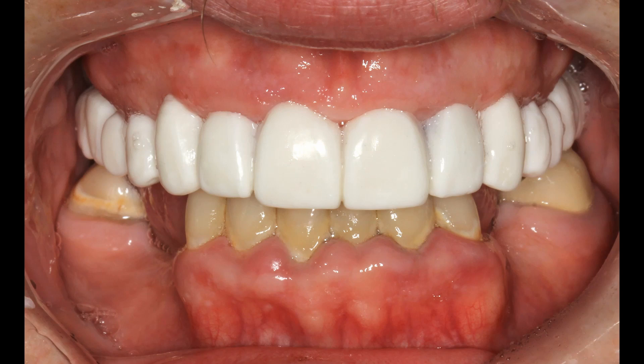I'd like to point out that when a patient plans to do their opposite arch in the future, we never allow that arch to dictate what we do while we're restoring the opposite arch. If you look over here, these molars — because they haven't had any teeth touching them for so long — they've come up through a process called super eruption, meaning they've moved from their original position. So even if it takes extracting those teeth, or more conservatively grinding them down, we're going to make the upper arch perfect and not be married to the lower arch. Whether that happens in a month or a year, we still don't want our upper outcome to be affected by an imperfect lower arch.